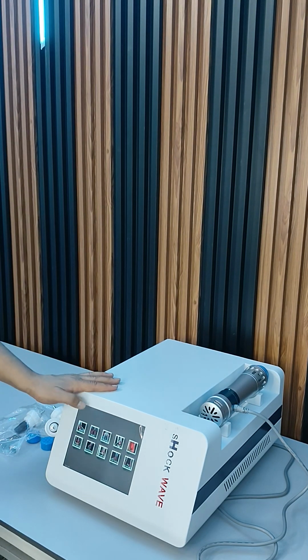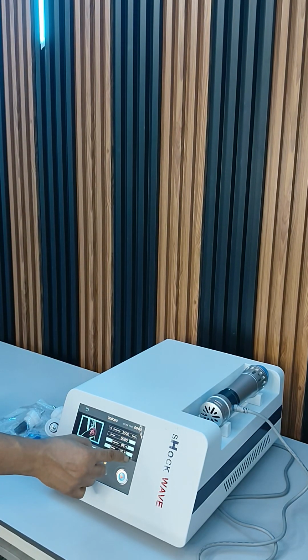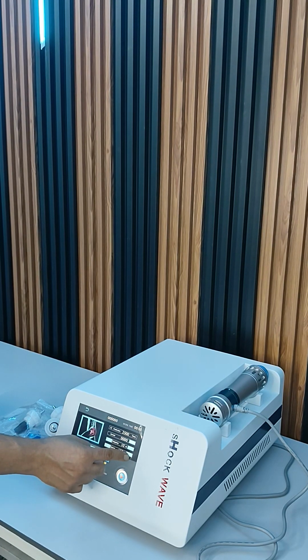So like this, if I go to the hip, the frequency here is 8 Hz and I can go up to 200. You can see, as I increase the frequency to 9, 10, the maximum varies.